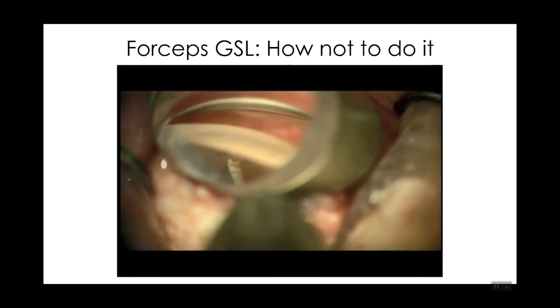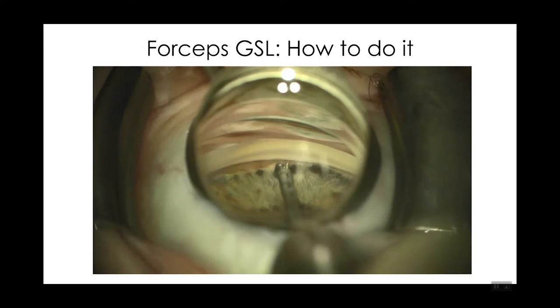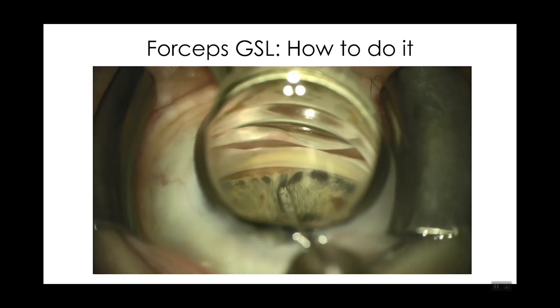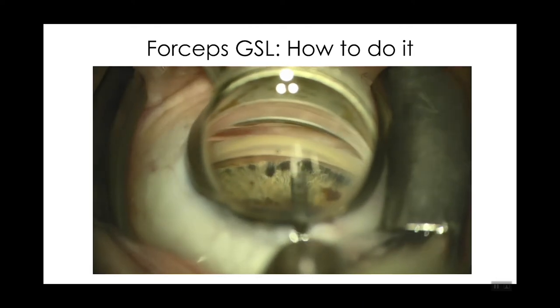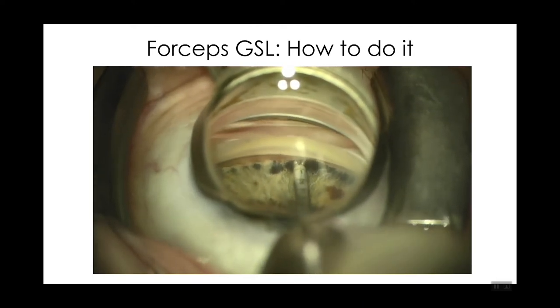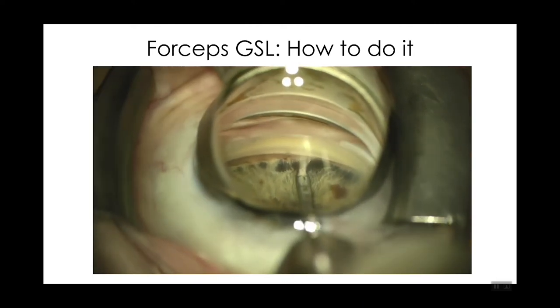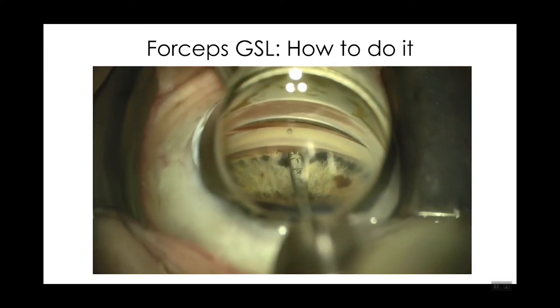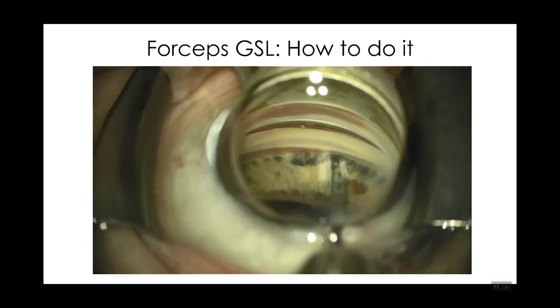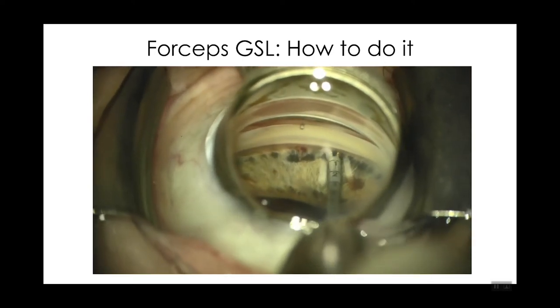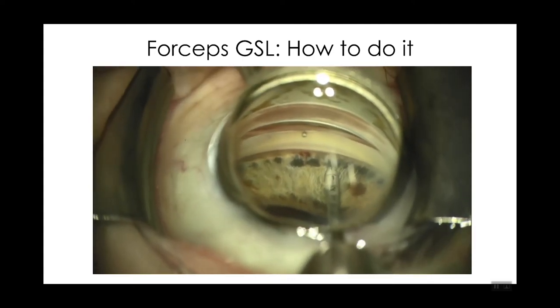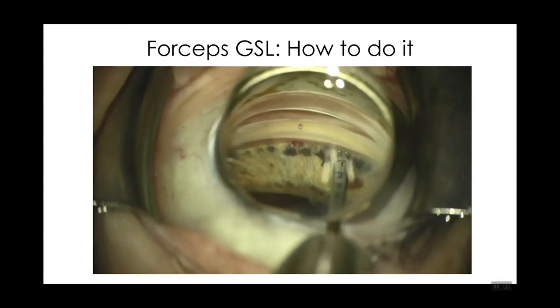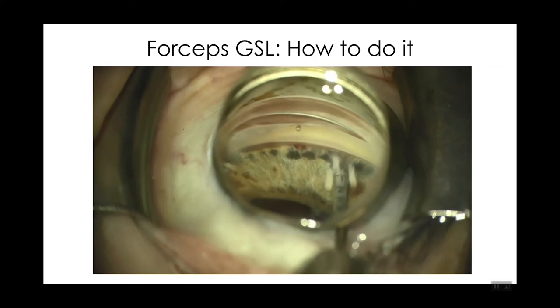Let me show exactly how to do that. This is an example using duet forceps — we're committing to grabbing the periphery of the iris and pulling down away from the trabecular meshwork. You can see the clear separation of attachments to the trabecular meshwork. This can be a really satisfying treatment when you see this intraoperatively. Again, we're committing to grabbing the tissue and pulling down gently.